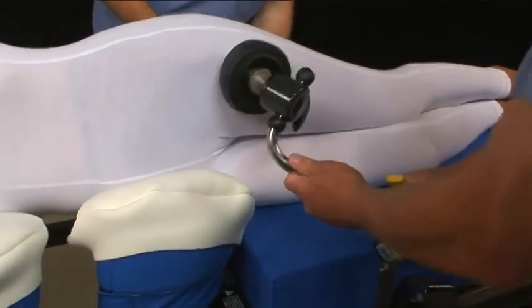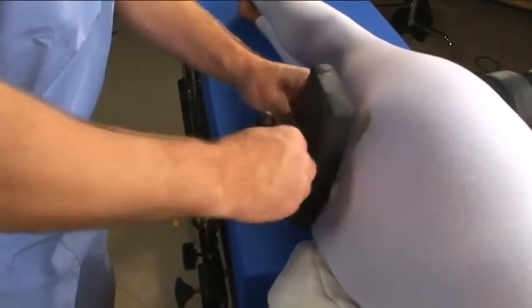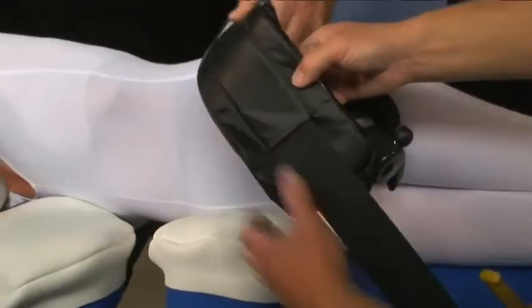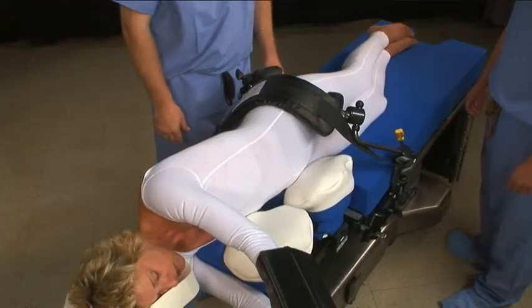Lateral braces can be used to support the patient in a fully lateral position. These can be attached to the rails of the OR table using standard rail clamps. To further stabilize the patient, you can apply a safety strap across the upper thigh, which can also be attached directly to the OR table rails.